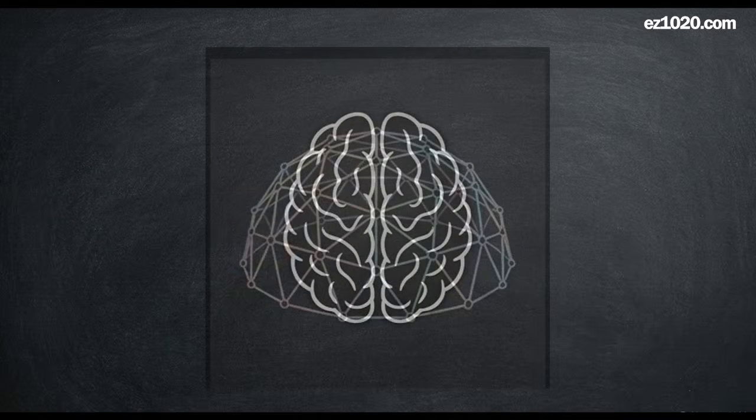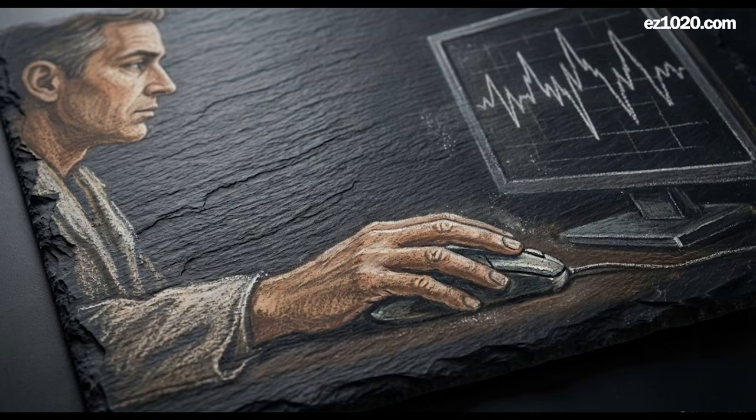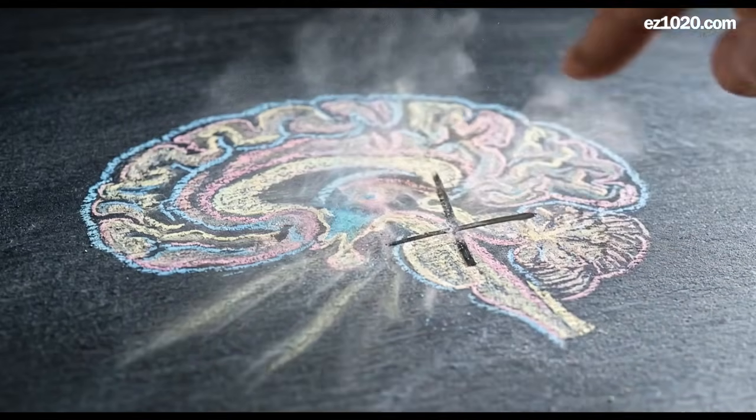Mapping this onto a topographical layout shows how altering the electrode coordinates physically shifts the apparent voltage hotspot. As a result, a discharge actually originating at the T3 location might artificially arise from the frontal F7 position simply because of a physical placement error. The interpreting physician cannot mathematically correct for this geometric drift. If the technologist shifts the voltage maxima through poor placement, they dictate a false localization to the physician.